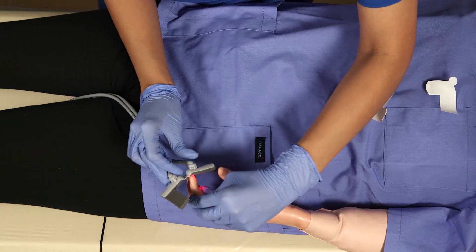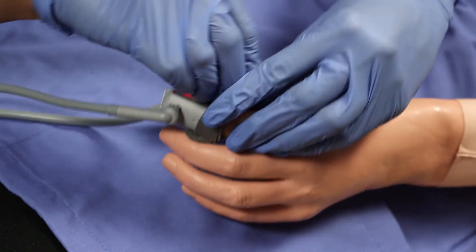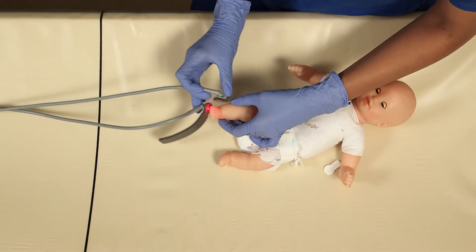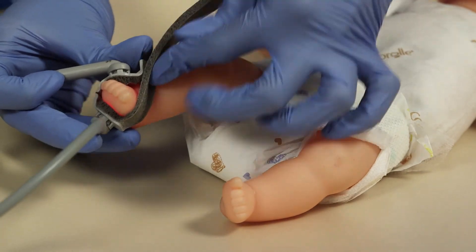The SpO2 clip goes on any finger you choose. Make sure the clip or disposable is secure. For the neonate, this can wrap around their foot or toe. Make sure you do not wrap too tightly and always check circulation.